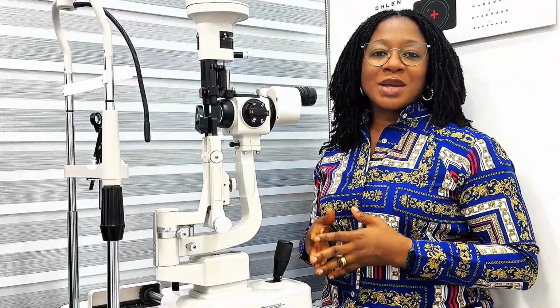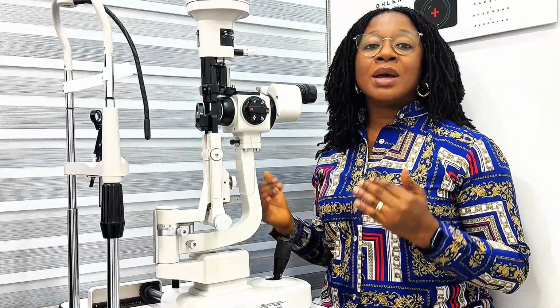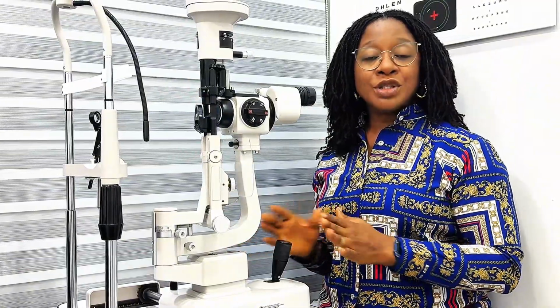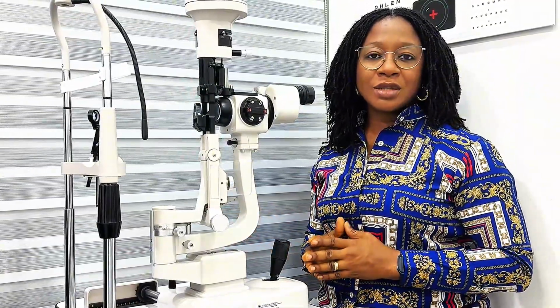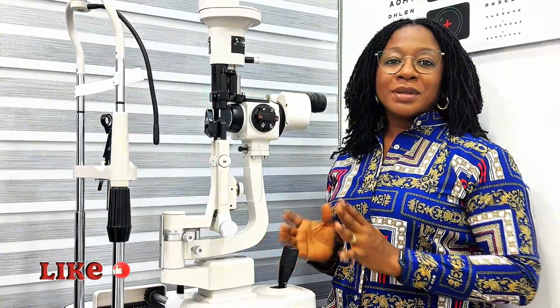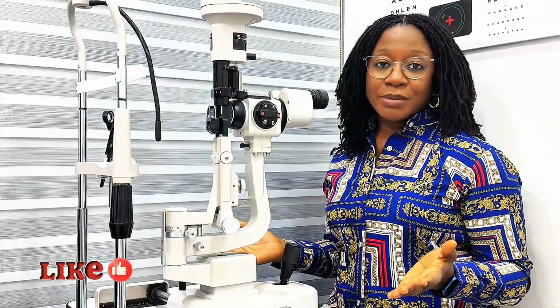Next, if you suspect that your patient is at risk of angle closure glaucoma, it's a good time to perform this technique and be sure that your patient's anterior chamber is not shallow. The Von Herick technique is not the only method that we can use to estimate our patient's anterior chamber depth.